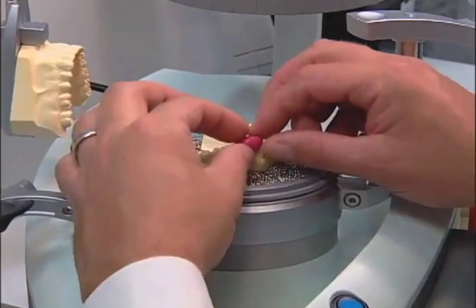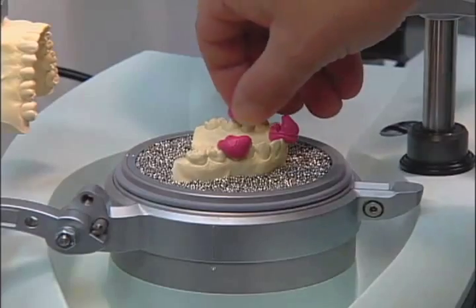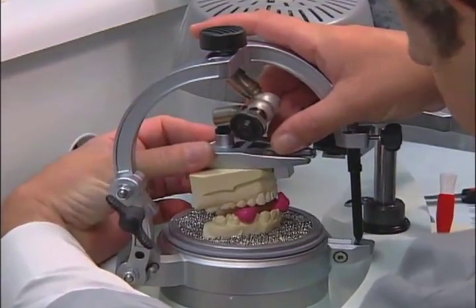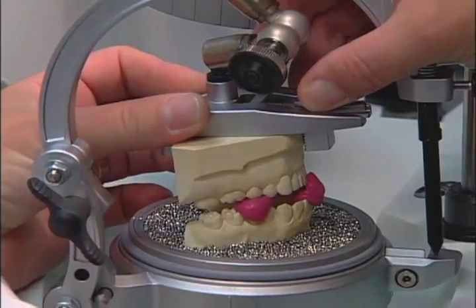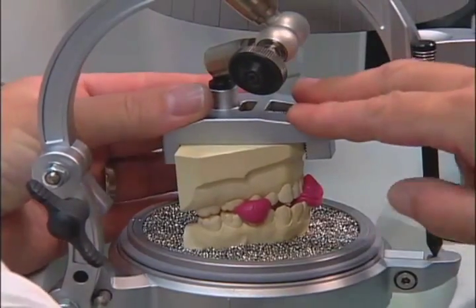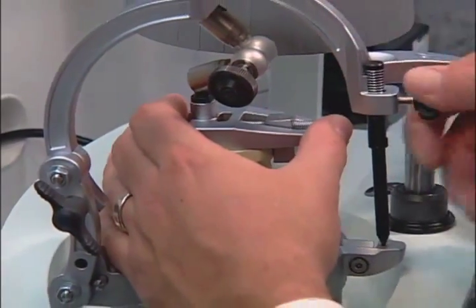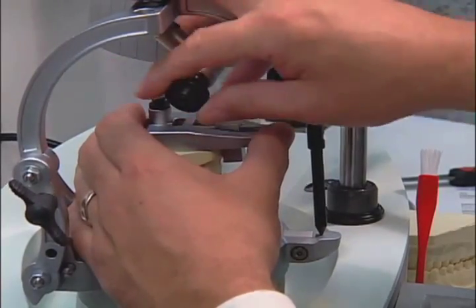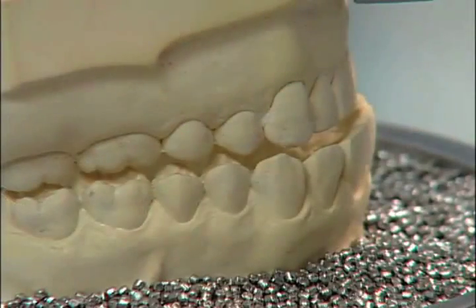With the model container in the thermoforming unit, position the open construction bite onto the upper model. Then loosen the joint screw on the Occluform hanger and position the opposing lower model into the bite. Be sure the joint screw is tightened completely. Remove the construction bite and close the Occluform.